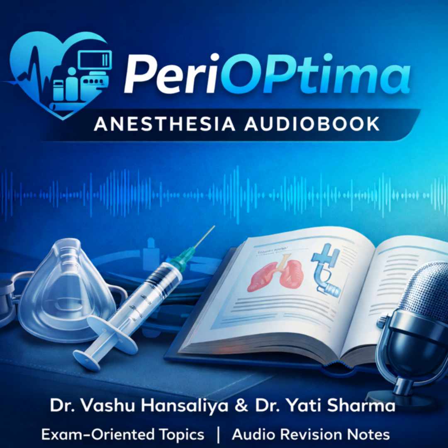And the cycling mechanism, how does it stop? It's volume cycled. The breath ends as soon as that target 480 milliliters has been delivered into the circuit. The advantage seems pretty obvious. You guarantee the patient's minute ventilation. You know exactly how much CO2 removal you're getting. Yes, that's its strength. Stability.